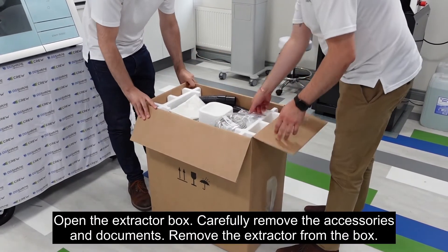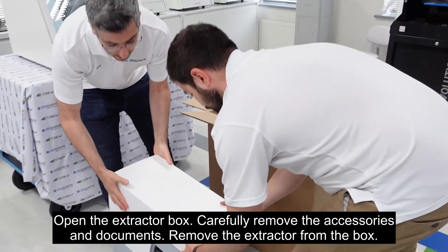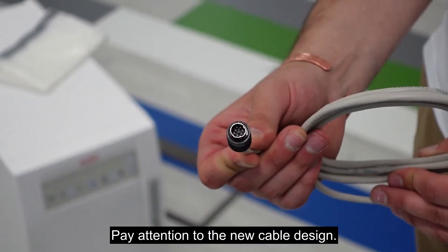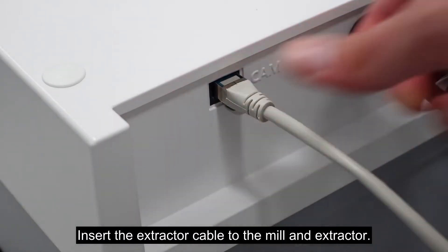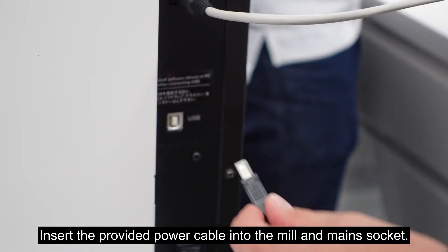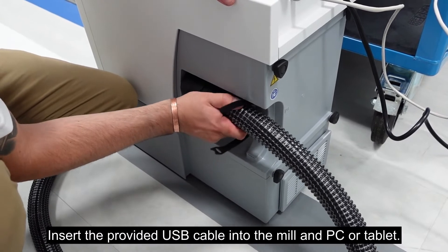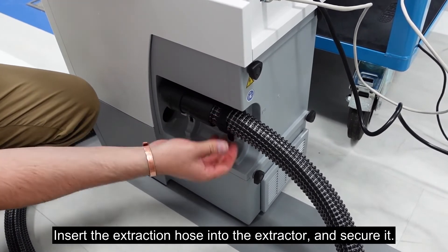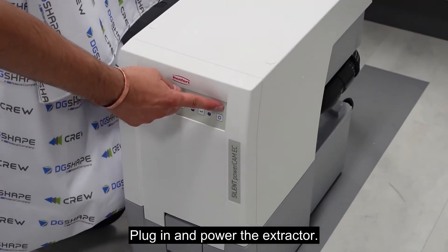Open the extractor box and carefully remove the accessories and documents. Remove the extractor from the box and pay attention to the new cable design. Insert the extractor cable to the mill and extractor. Insert the provided power cable into the mill and main socket. Insert the provided USB cable into the mill and PC or tablet. Insert the extraction hose into the extractor and secure, then insert the extraction hose into the mill. Plug in and power the extractor.